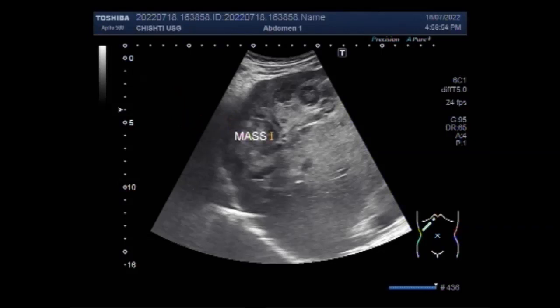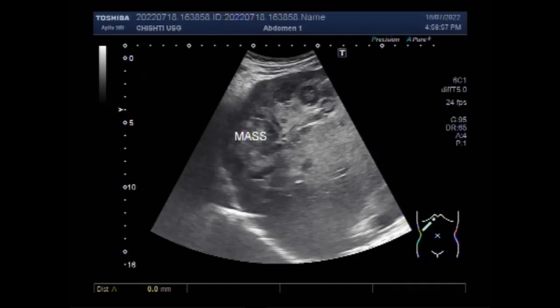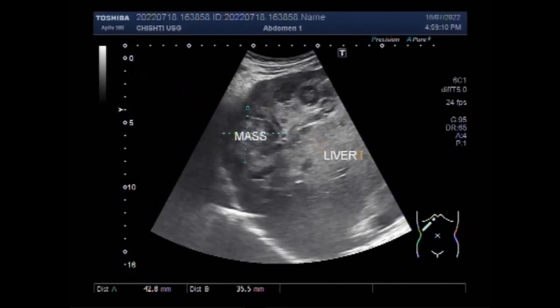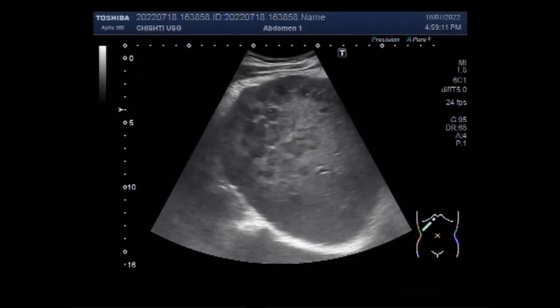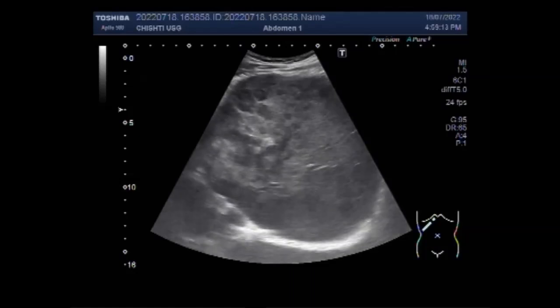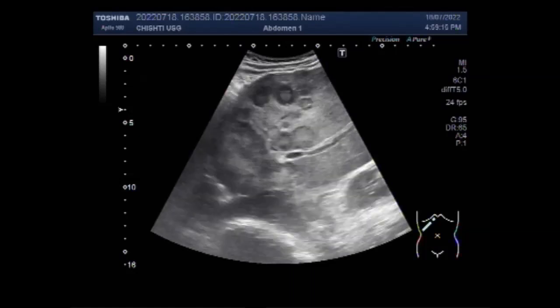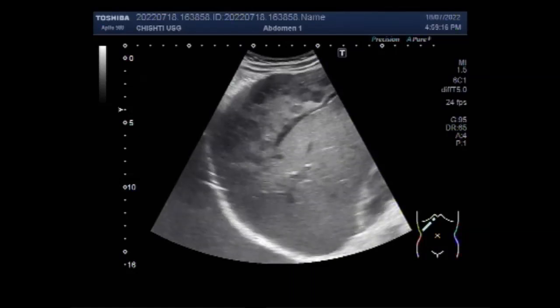The ultrasound imaging features of metastasis from GIT are as follows: bull's eye appearance, as you can see in this case; multiple masses; irregular tumor border; arterial rim-like enhancement; and hypo enhancement in late vascular phase.